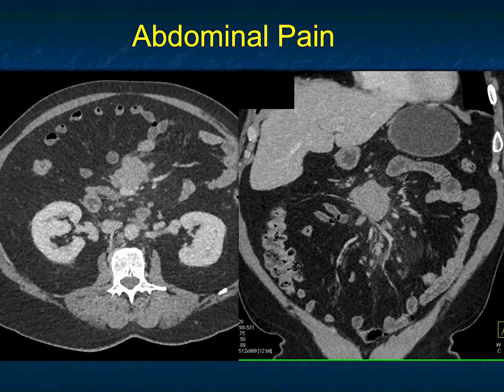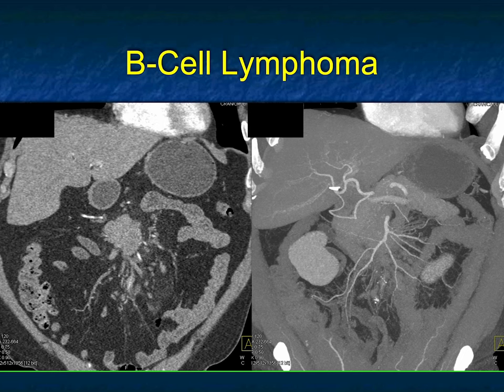That doesn't exclude carcinoid or a desmoplastic reaction. Most things can give you some desmoplastic reaction, but carcinoid gives the most impressive — and I'm not seeing that here. I'm seeing some haziness in the mesentery and additional nodes. It could be Castleman's disease — a well-defined enhancing mass — but that doesn't explain the additional adenopathy. You also need to think about lymphoma. Lymphoma can occur as big or small masses, and in some cases you see the so-called sandwich sign with vessels and bowel.